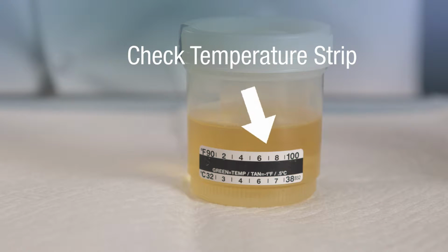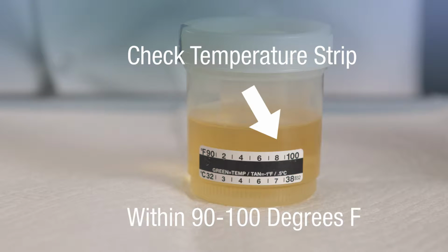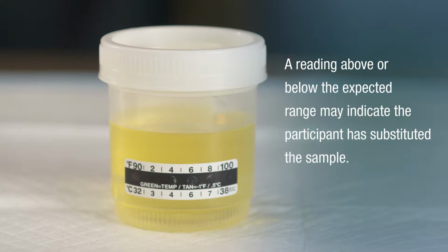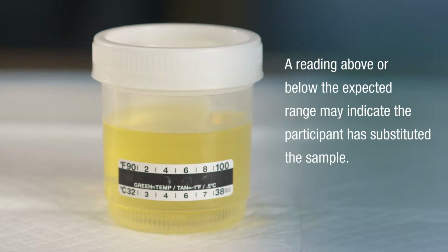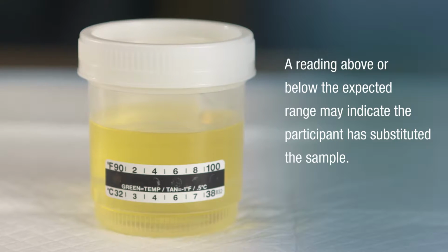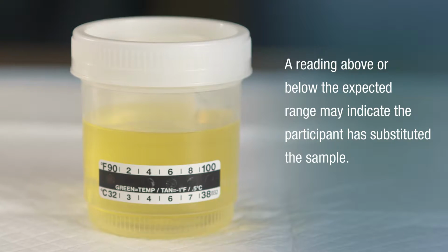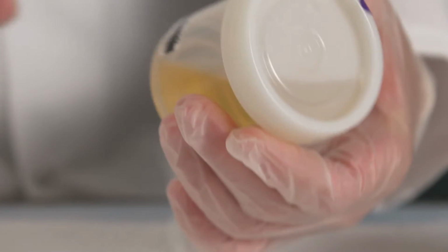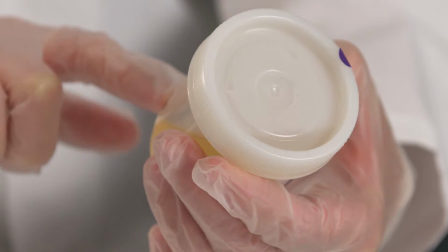Once an adequate urine sample has been obtained and you have put on your gloves, check to make sure that the temperature on the strip is within the adequate range of 90 to 100 degrees Fahrenheit. Temperature is important, and a reading that is above or below the expected temperature range may indicate that the participant has substituted the sample with urine that did not originate from his or her own body. Any sample that is outside of this range is considered adulterated.